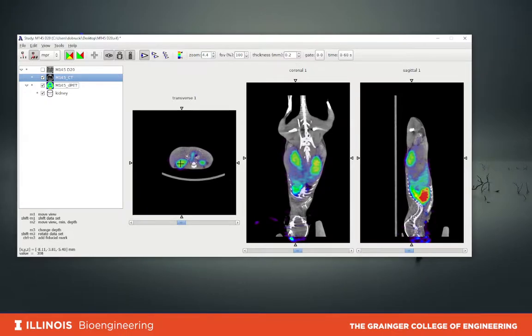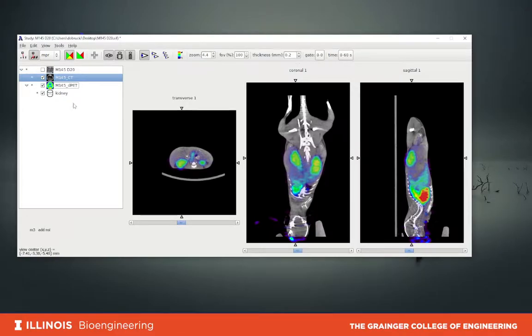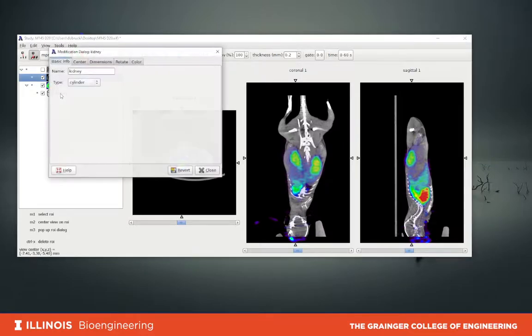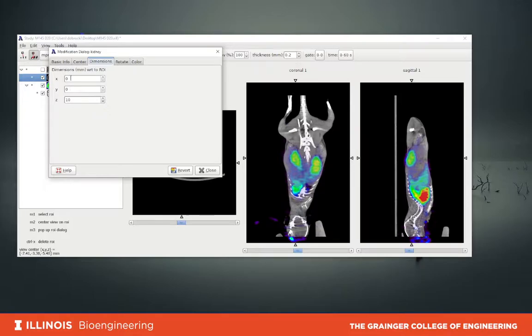Now we've defined the depth of the region of interest going 10 millimeters in depth, but we don't see any region of interest on the image. If you right-click on the region of interest, another window opens showing the dimensions of the region called 'kidney'. We can see that the Z direction — the depth — is defined as 10 millimeters, but we didn't specify X and Y. Let me select 10 millimeters by 10 millimeters, and leave the depth at 10 millimeters, making a cylinder of 10×10×10 mm.